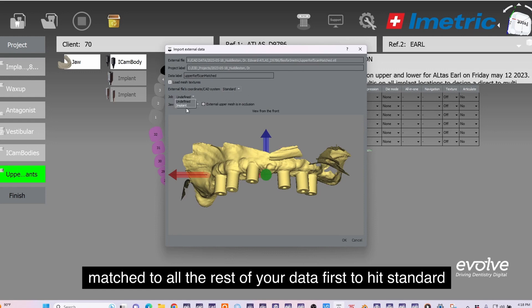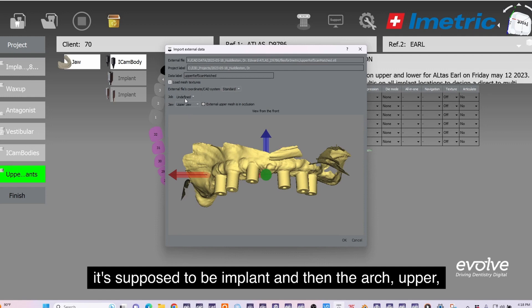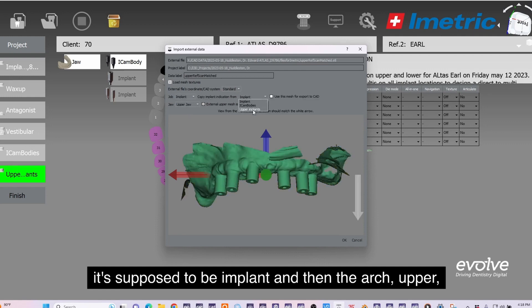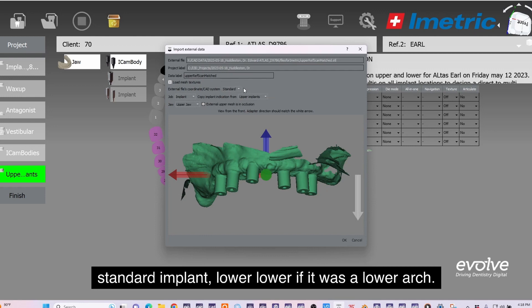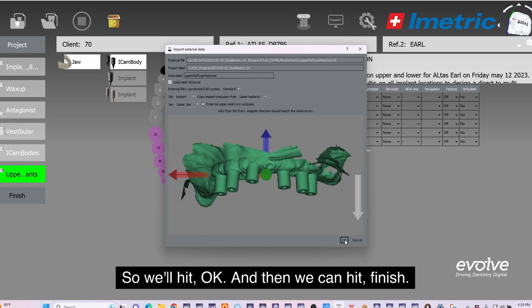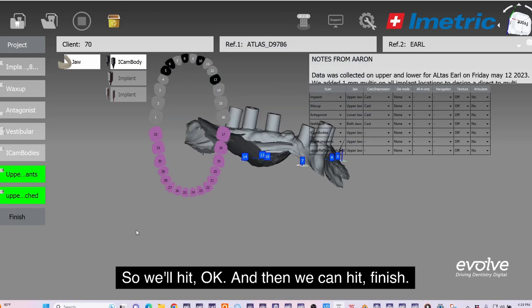When it's standard, it's supposed to be implant and then the arch. Upper upper standard implant upper upper. It would be standard implant lower lower if it was a lower arch. We'll hit okay and then we hit finish.